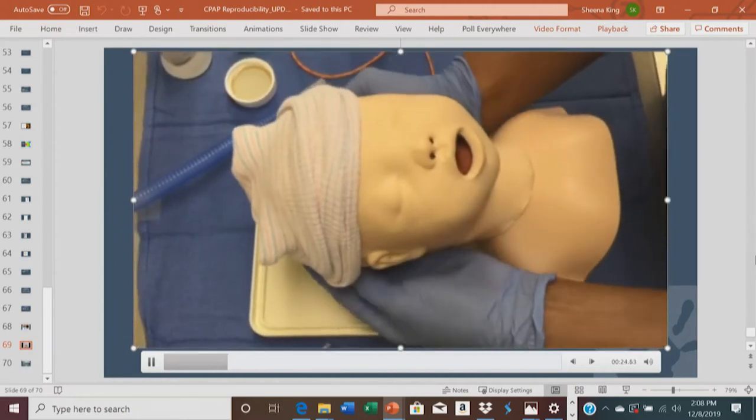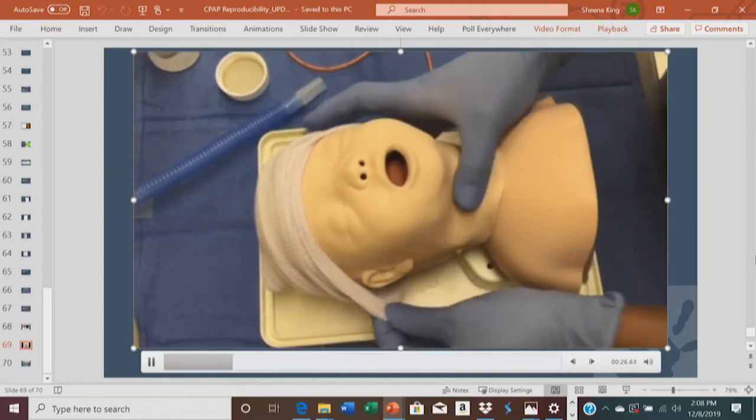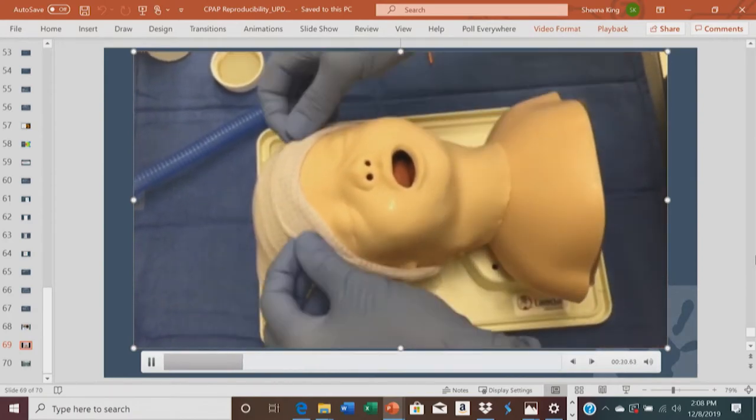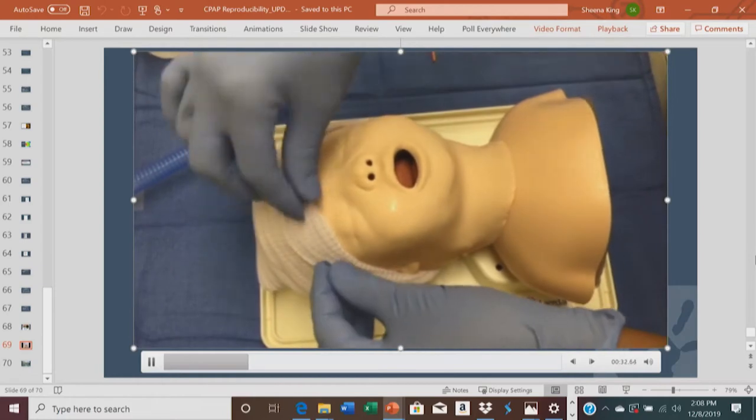Place the snugly fitting hat on the patient, covering the low occipital part of the head. We define snugly fitting as no more than one finger fitting under the hat.